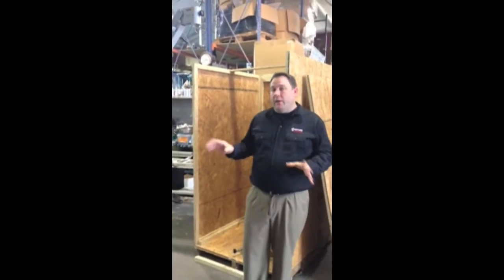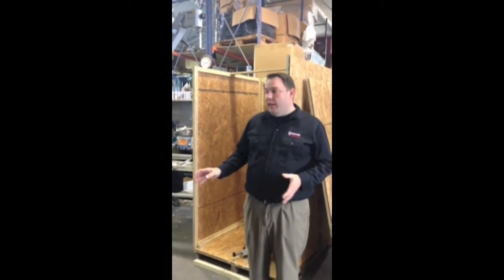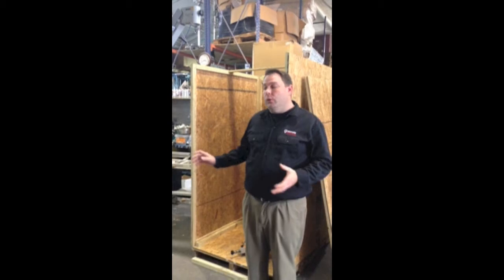Hi, I'm John with Venture Medical. I'm going to show you how you're going to receive your Zeiss Opni 1 S1 scope and how to put the head assembly back on the scope once you receive it.